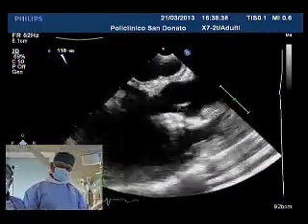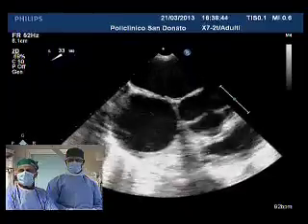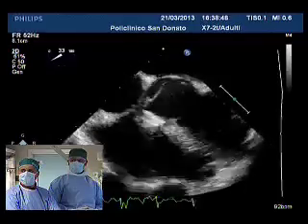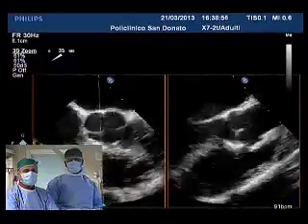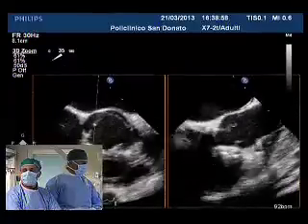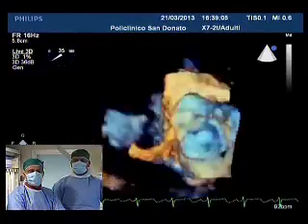Yeah, I agree with you, Ziad. I didn't know you had this device. If not, I would have. It would have been my first choice. Thank you. And again, I agree that there were AV blocks in the first series. This patient normally does not have many risk factors for the AV block issue. Your device is nicely inside the aneurysm. You didn't oversize. It's not a small patient. It was not an inlet extension perimembranous VSD.